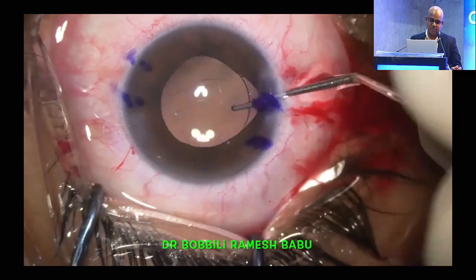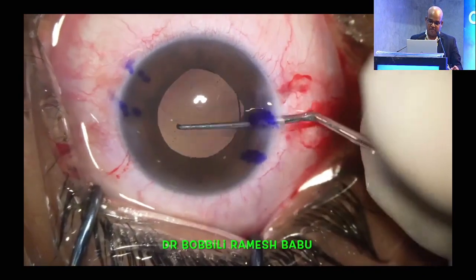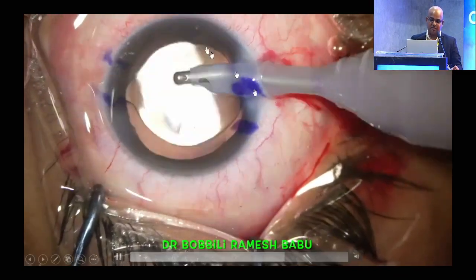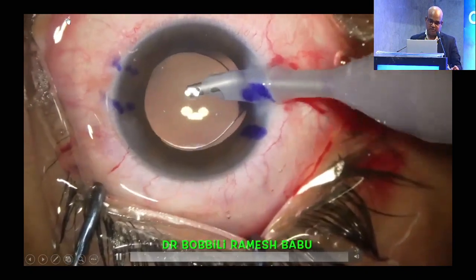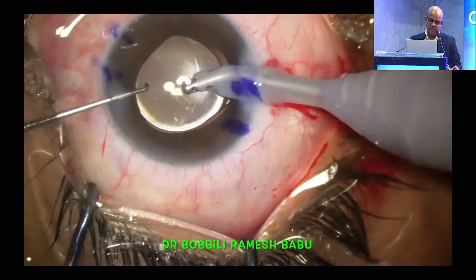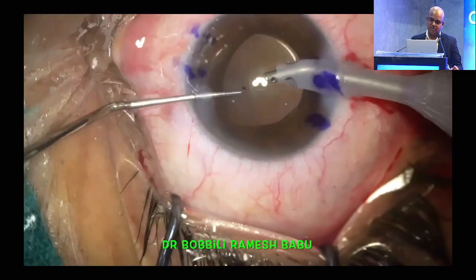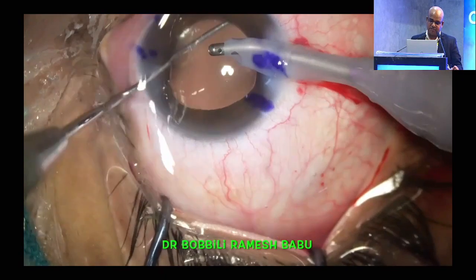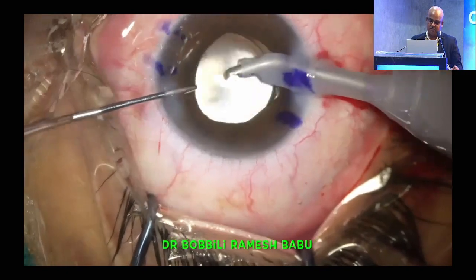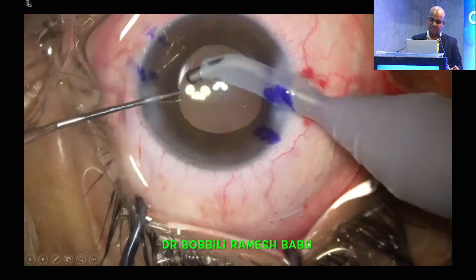This one is implanted into the bag. Now for the viscoelastic removal, I stop about 2 clock hours short of the required placement. This is the horizontal axis, and this one is the intended axis here. After removing the viscoelastic from anterior and behind the IOL, the IOL is rotated to the required position. The viscoelastic is being removed from behind the IOL. Now you can see the lens is done.